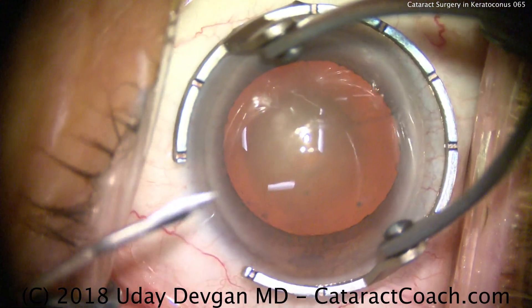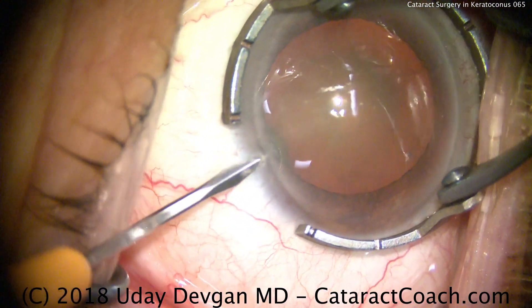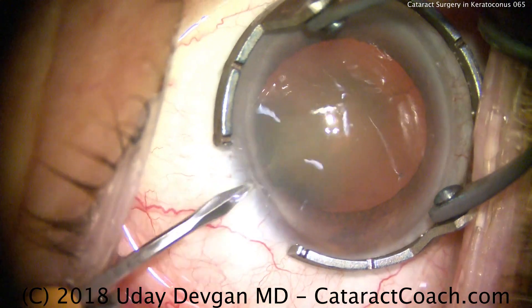CataractCoach.com — cataract surgery in a patient with keratoconus. How is that going to be different? Let me teach you.